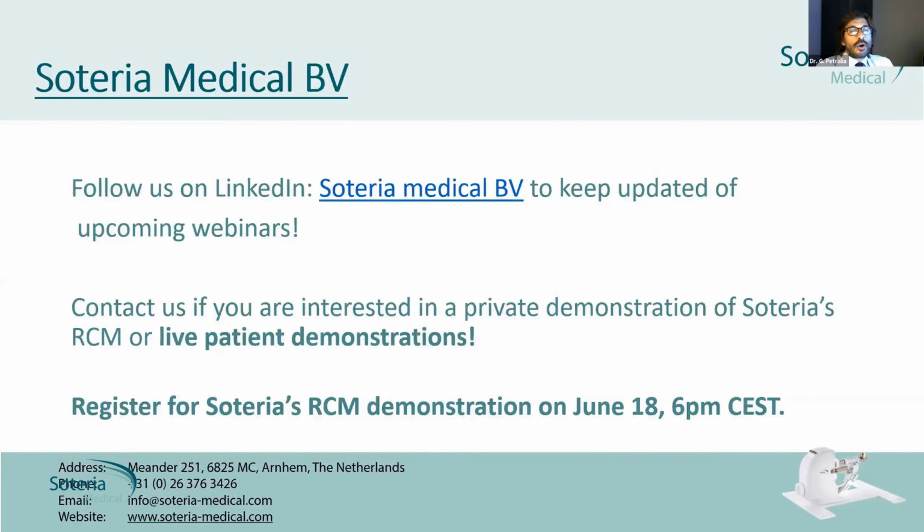Now I can comment on that because we've been doing in-bore MRI guided biopsy for the last 6 years. So we learned how to deal with each other, urologists and radiologists. Basically, the first biopsy-naive is mostly performed by urologists because they do systematic plus targeted, and they do fusion biopsy. So we are like a second level. When there is a very suspicious lesion, or a very difficult lesion for them, it is discussed at the MDT. We only do selected biopsy-naive patients, or if the patient has had a previous negative biopsy but the MRI is positive, in that case we do in-bore biopsy. So we share the market. If that was the question, we share it.